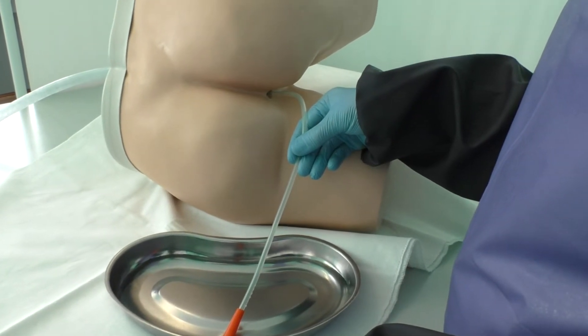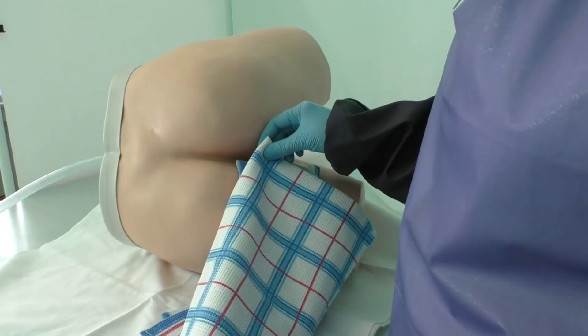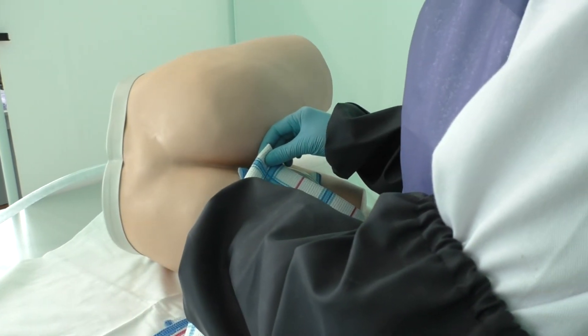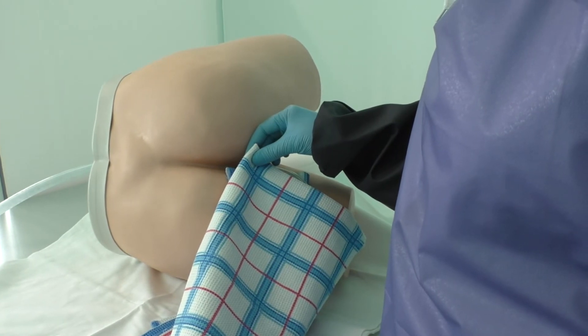Gently remove the rectal tube. Dry the patient's perineal area using gauze squares and napkins. Help the patient get dressed if necessary. Ensure that the patient has access to the nurse call system.